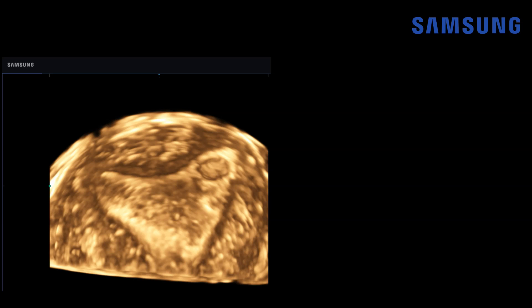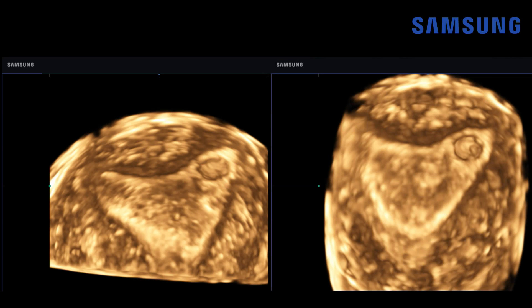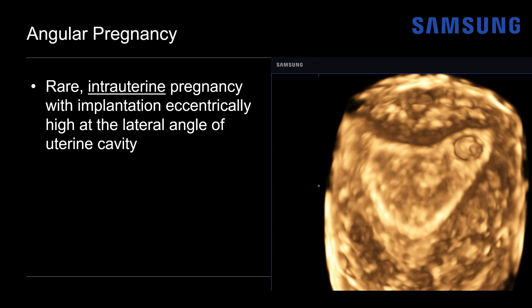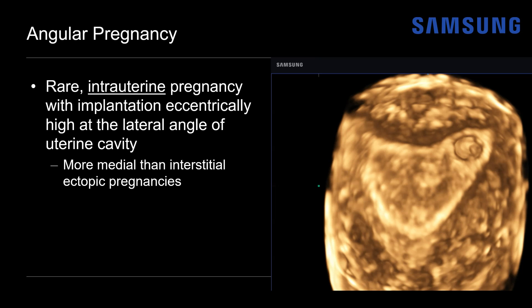What can be quite helpful is to generate 3D reformatted images. Here we have a coned-down view of the uterine fundus looking at the endometrial cavity, and we can see that this gestational sac is laterally and eccentrically located within the endometrial cavity — but it is an intrauterine implantation. A slightly angled view again shows the gestational sac at the angle of the uterine cavity. This is known as an angular pregnancy — an intrauterine pregnancy with implantation eccentrically high at the lateral angle of the uterine cavity. Angular pregnancies are more medially located than interstitial ectopic pregnancies, which are located where the interstitial portion of the fallopian tube would be.